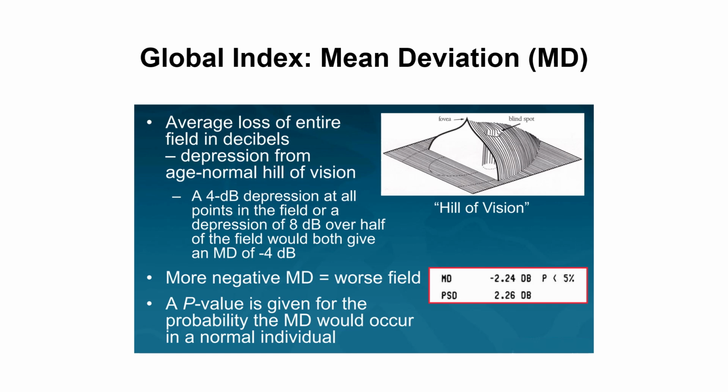As we said previously, the hill of vision is like a conceptual model to understand the visual field, normal and abnormal perimetry, representing the hill. The maximum point of the hill is the fovea, where there is the maximal visual threshold sensitivity. And when you go to the periphery, there is a reduction in this retinal sensitivity to the visual threshold. In a glaucoma patient, they will start losing in the periphery. However, in a patient with optic neuritis, for example, the loss starts in the central hill of vision.